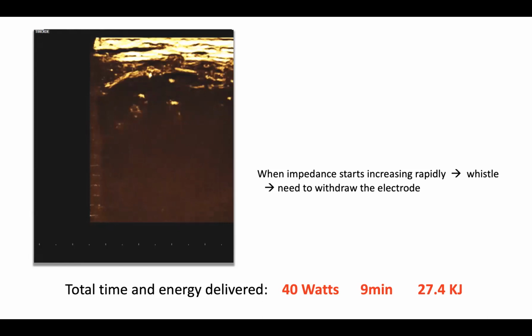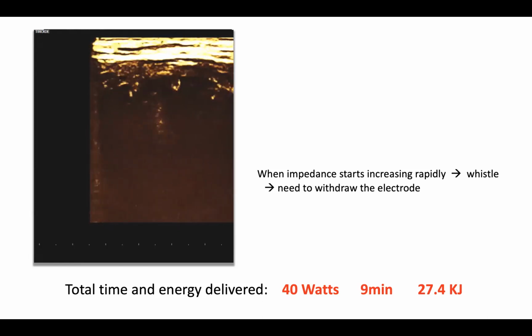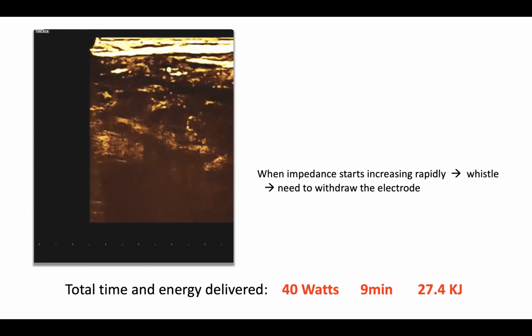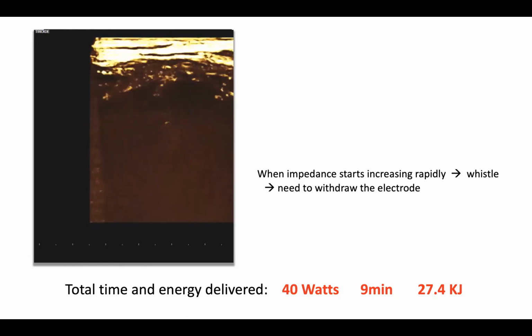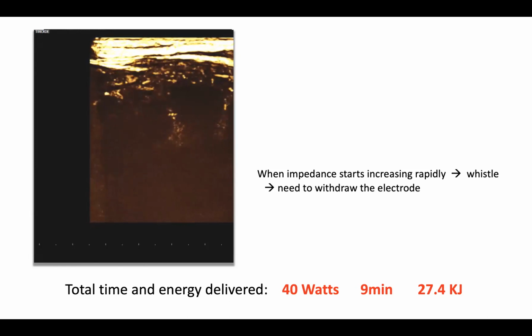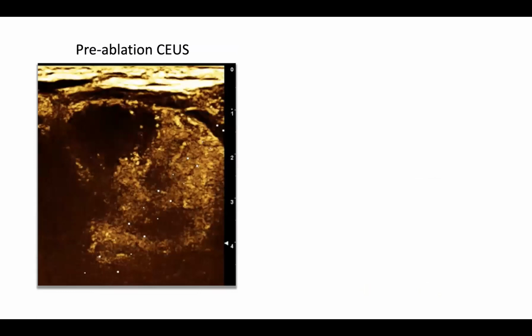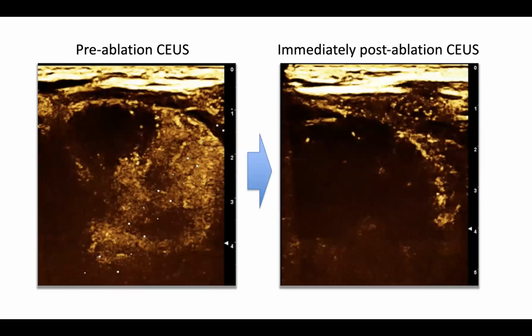In this specific case, we delivered 40 watts for 9 minutes and a number of joules of 27.4 kilojoules. This is the pre-ablation image of the lesion, and this is the post-ablation, as I said, demonstrating the complete disappearance of all the solid portions of the lesion.